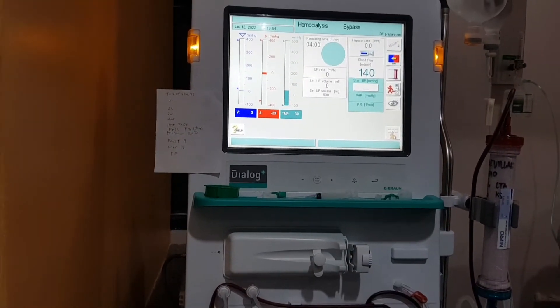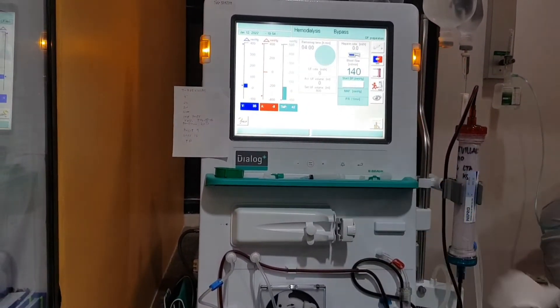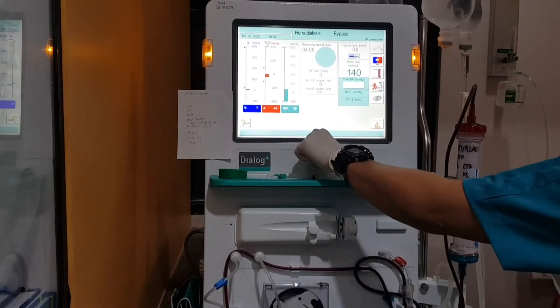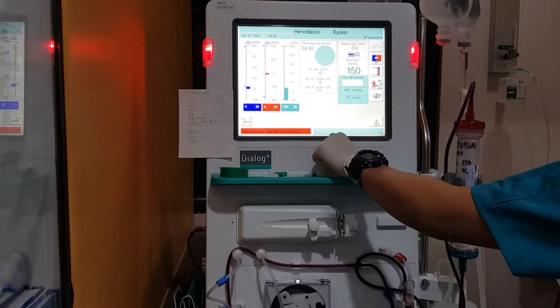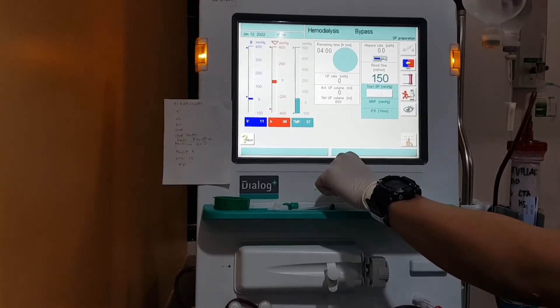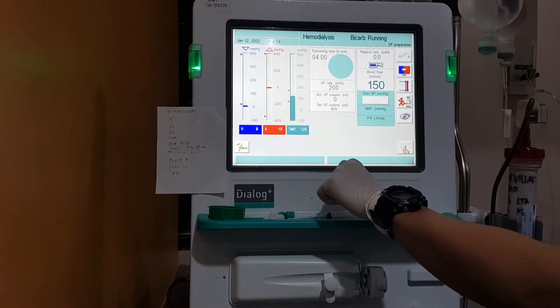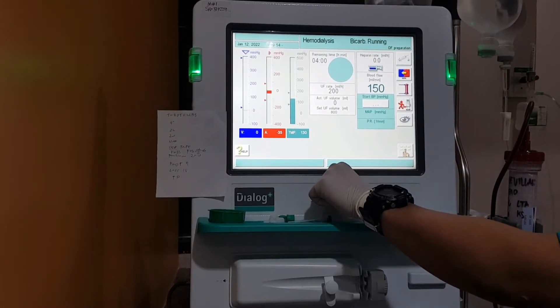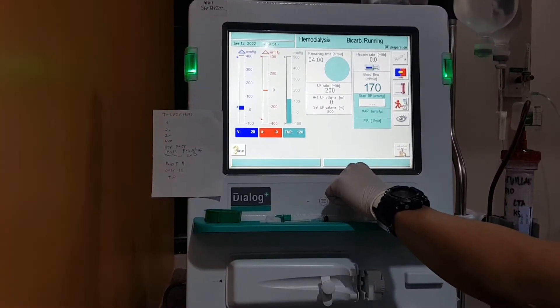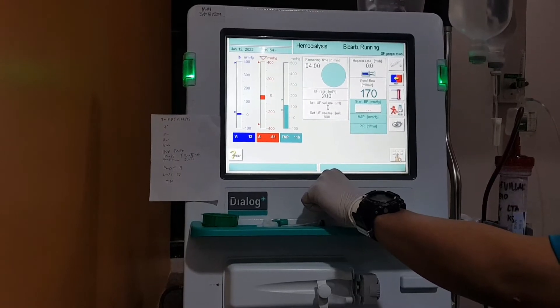As a note, pressing the alarm button once will only mute the sound. Pressing it twice will continue treatment. There are alarms that will automatically stop the blood pump, so be careful always. Make sure to press it twice to activate the blood pump again.